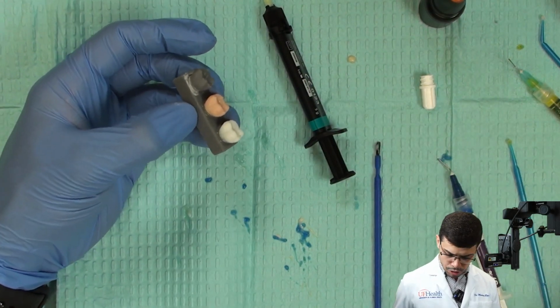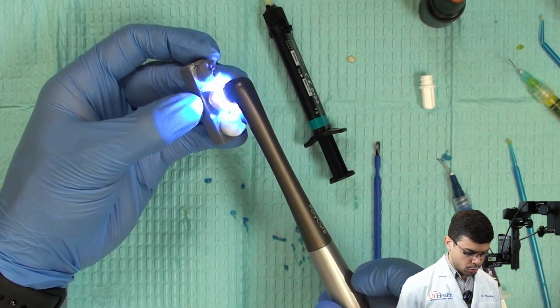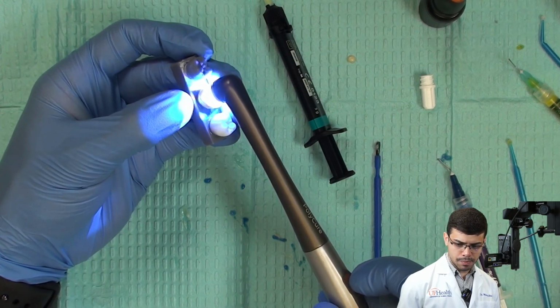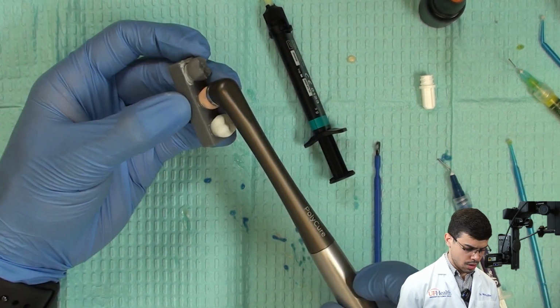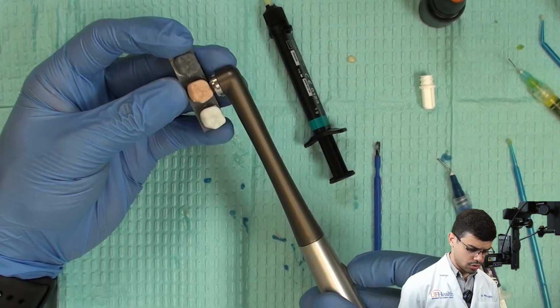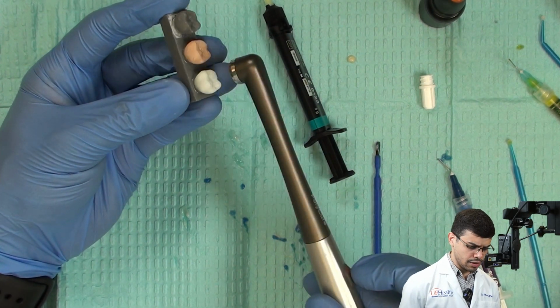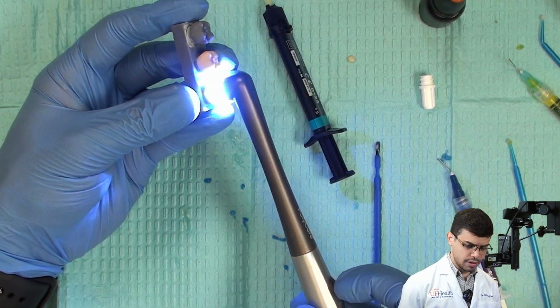So to light cure this, you're gonna have to start on the occlusal with your curing light and light cure for 20 seconds. So I will light cure here. So 20 seconds on the occlusal. Then you move and do 20 seconds on the buccal and 20 seconds on the lingual. All right, so you light cure every 20 seconds here. Now I'm gonna do the same thing for the zirconia.